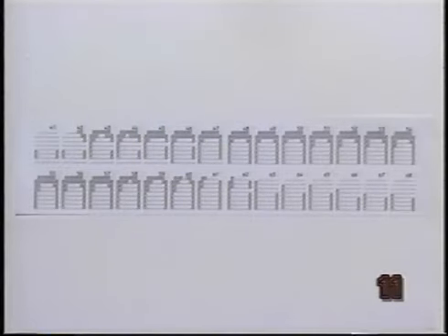This display shows a sequence of palatal frames sampled at 10 millisecond intervals for the initial plosive in the word TED. From this full contact data, a graph can be constructed showing the total number of contacts occurring in different regions of the palate. Here we see a display showing the total number of contacts in 3 regions of the palate for the first 100 frames in the utterance.